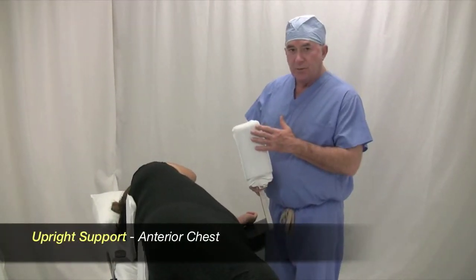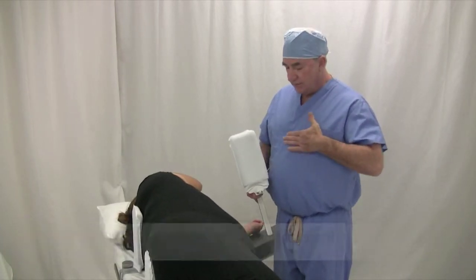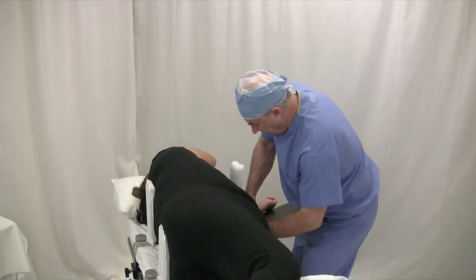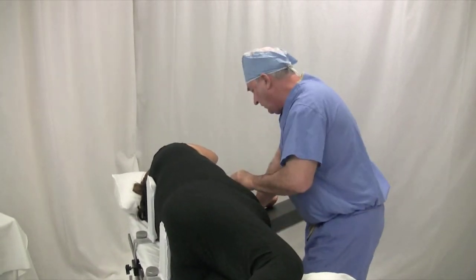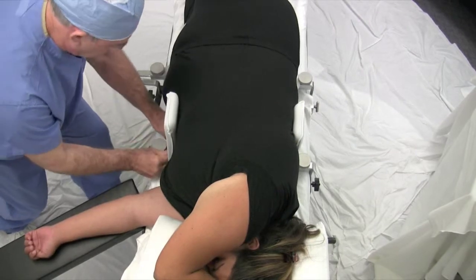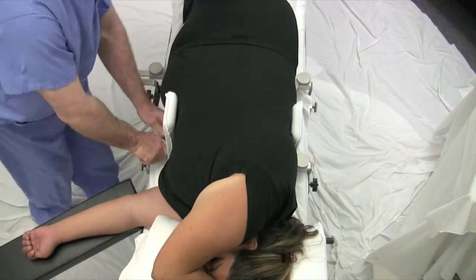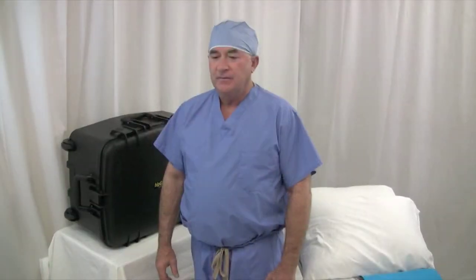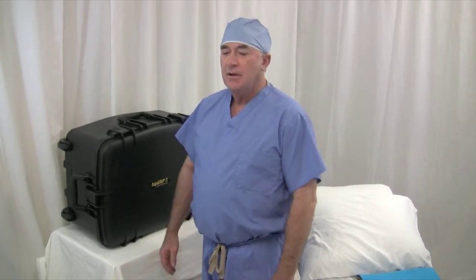The anterior chest support goes just below the breasts and supports on the lower part of the sternum. Hopefully this will allow you, the orthopedic surgeon, to appropriately place your patient in a very deliberate and solid fashion on the operating table for your hip surgeries.